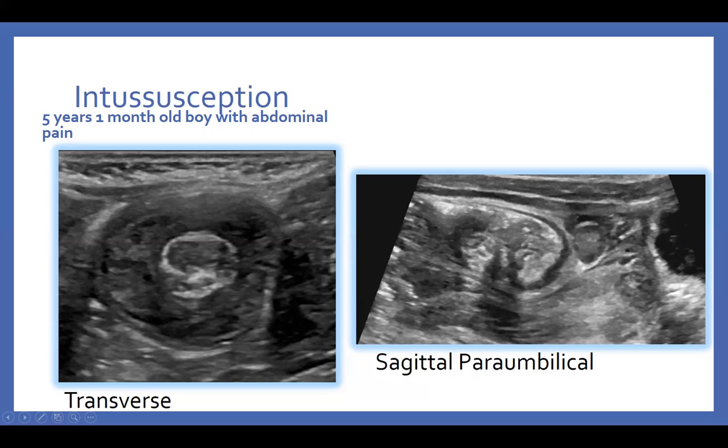So here we go. If I say now I see the intussusception in grayscale, it's in front of my eyes, great.